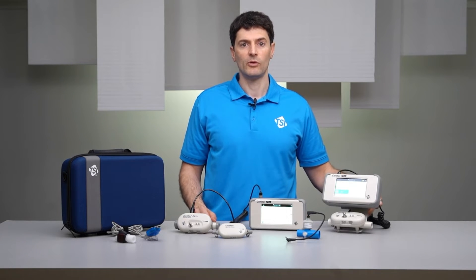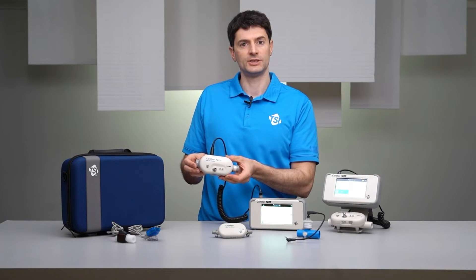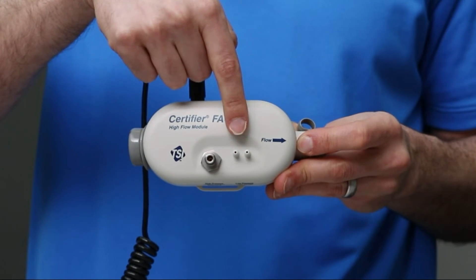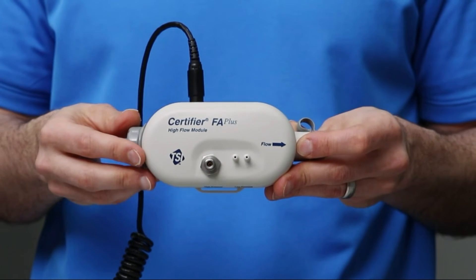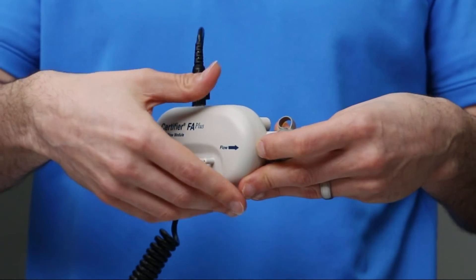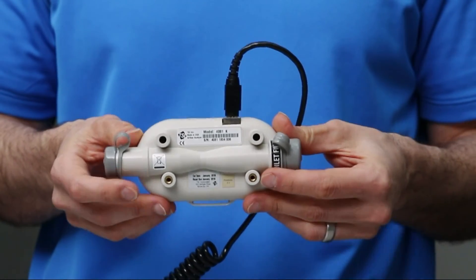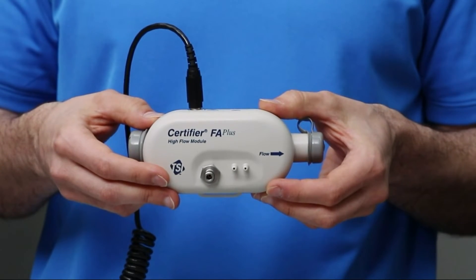The Model 4081 high flow module can measure air and oxygen flows up to 300 liters per minute, as well as measure the breathing circuit pressure and the high pressure. An oxygen sensor can be plugged into the high flow module to measure the oxygen concentration of gas flows. The high flow module is used most commonly for testing mechanical ventilators and can test any ventilator type or model.